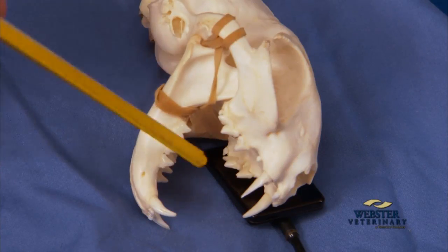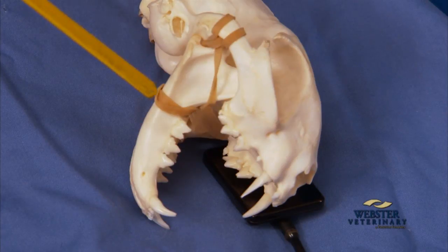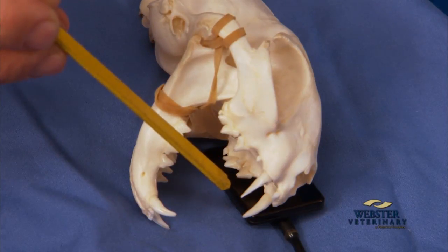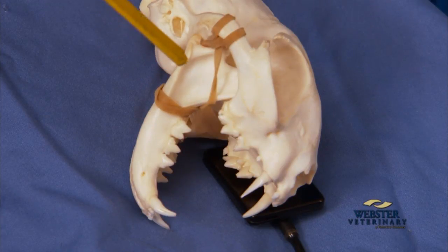In this technique, the sensor is placed extraorally underneath the patient's head. The crowns of the teeth are aligned at the tip of the sensor so that the roots may be projected to the center of the sensor.